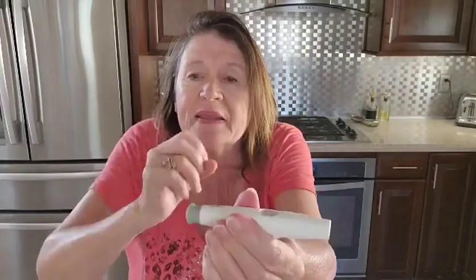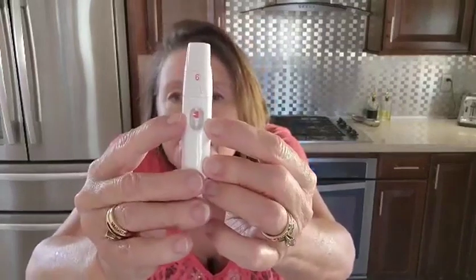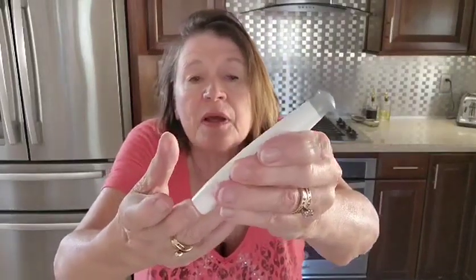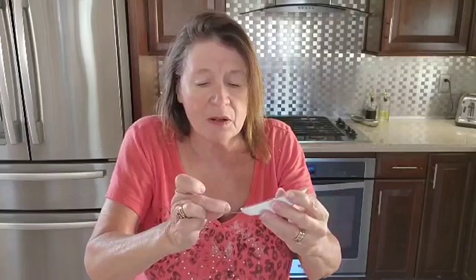After you have your lancet in there, you're going to pull this back, which activates the little red dot to let you know you're ready to go. You're going to clean off your finger with a little alcohol strip, go ahead and put this onto your finger and just poke. Press that button where the red dot is, get your blood flowing, insert your strip right into the machine, and you'll see it flashing. Make sure you've got blood on your finger and go ahead and put that blood right onto your strip.